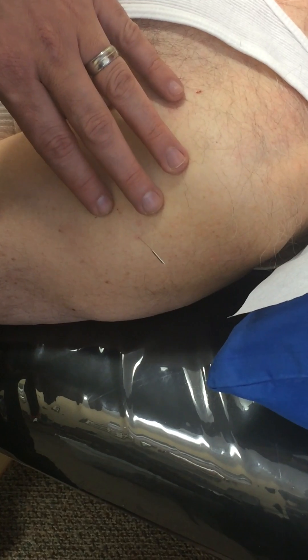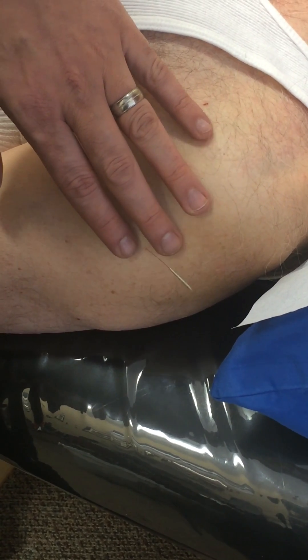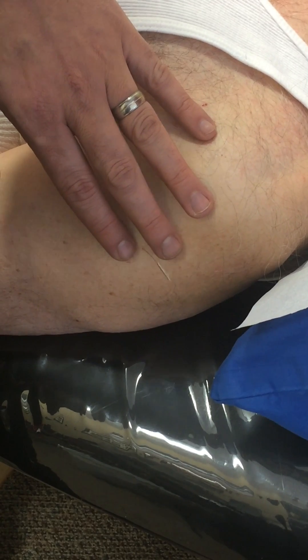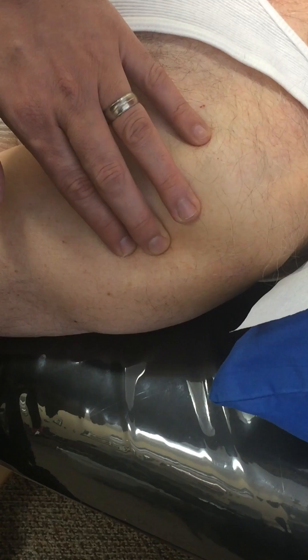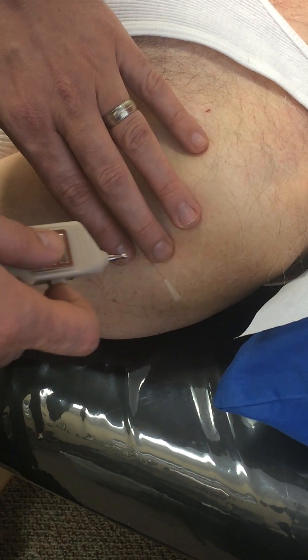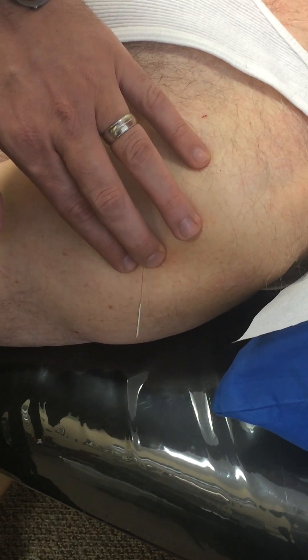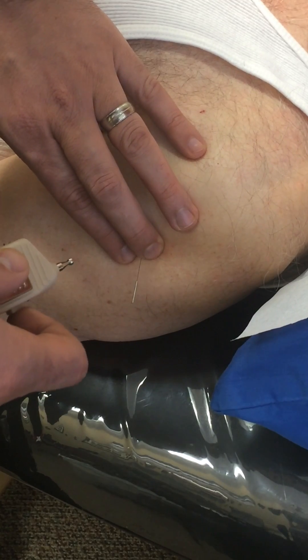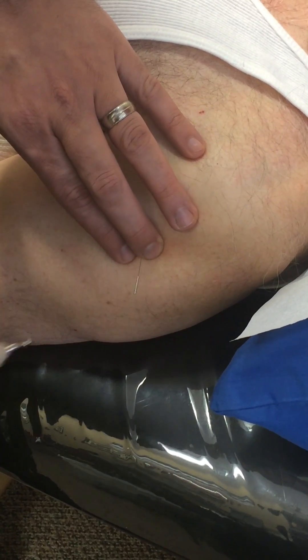With my non-dominant hand over the needle, I'm placing my hand around the needle — around the tissue — and I depress the tissue to take out the tissue pull. Part of the needle is actually contacting my hand; that's fine. What that does is it directs electron flow into the muscle — in this case, the motor point of the lateral deltoid.